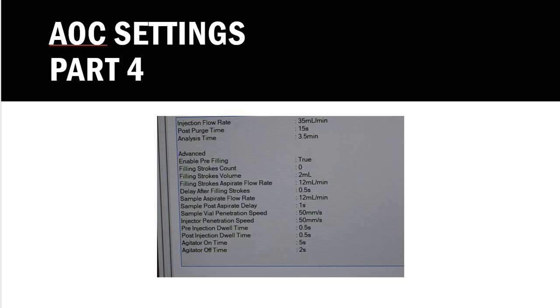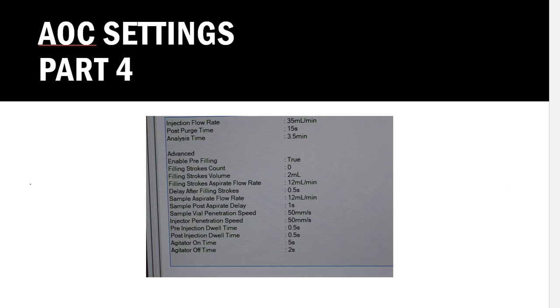So as you can imagine, again, I don't want to do this every time, right? I'm going to take a document, someone's made those determinations, we have to follow the way that that is written, and someone goes in and they make sure that those settings are valid. Once that's done, they save it, and that's what we call a method. Then someone else later can take advantage of opening a method file, and we can upload those parameters with the snap of a finger.